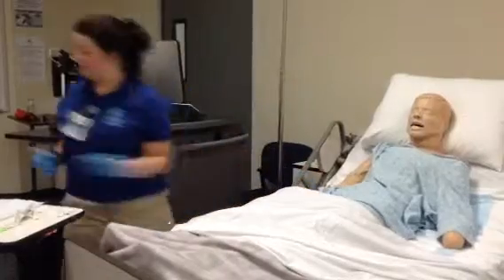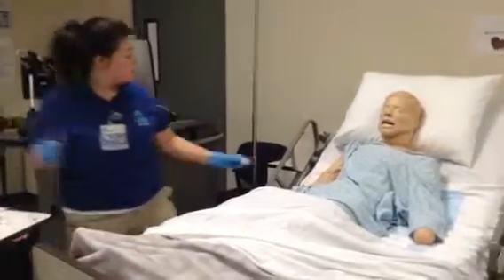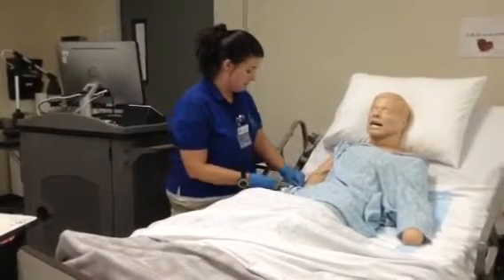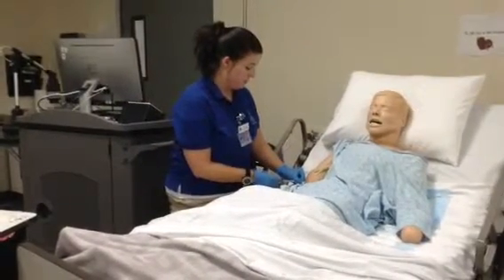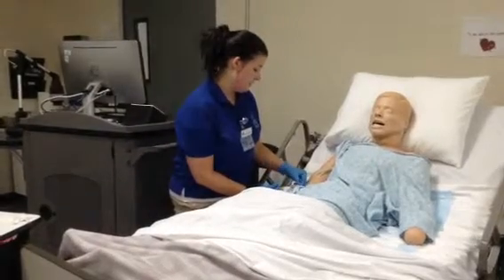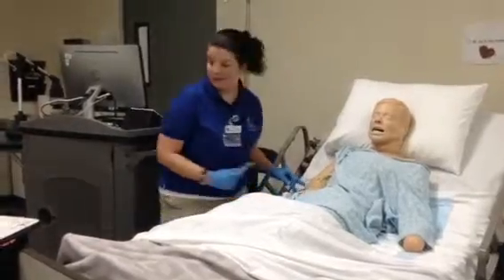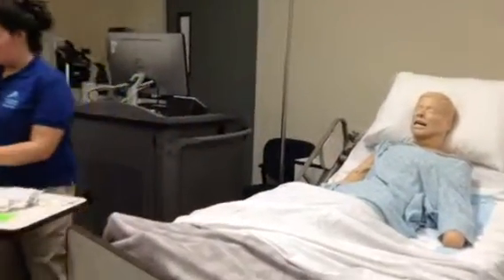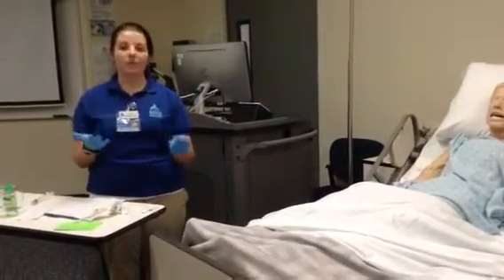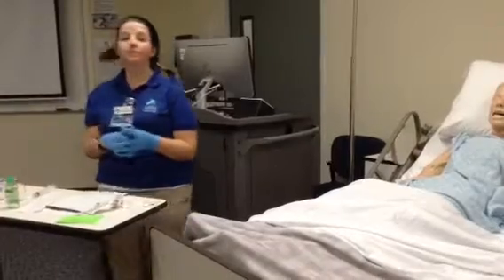Let me get a new one because I dropped that. Clean my site. Administer my 3 milliliters of saline to flush. Alrighty. Okay, take that out, and everything will go in the sharps or the trash. And if I was doing a complete SASH, I would administer heparin, and that would be for like a PICC line or a central line.